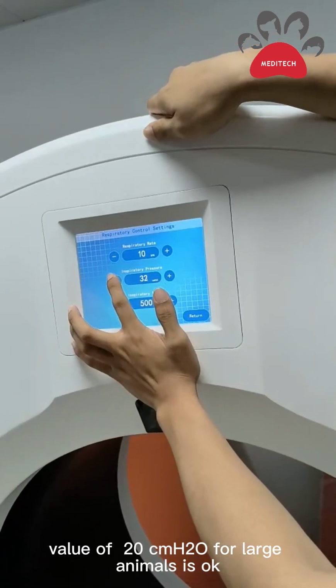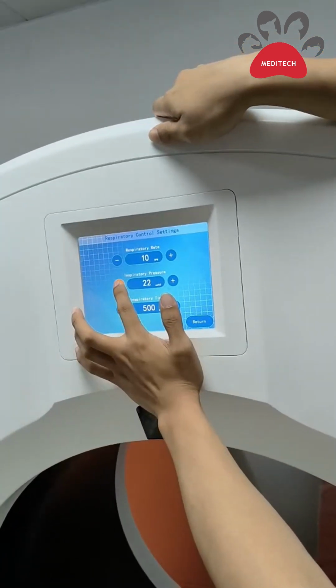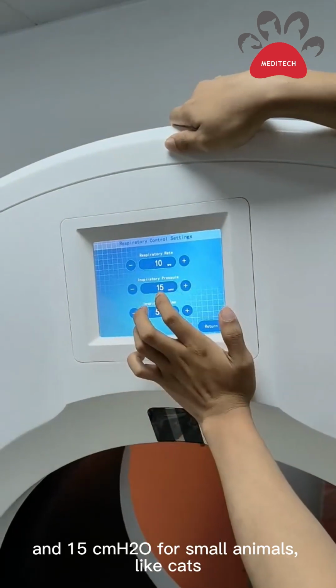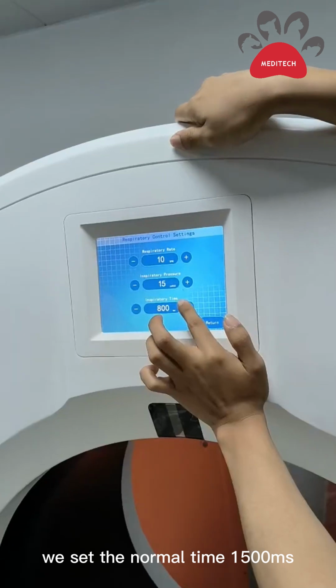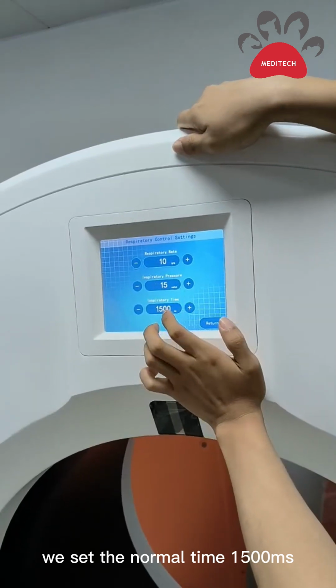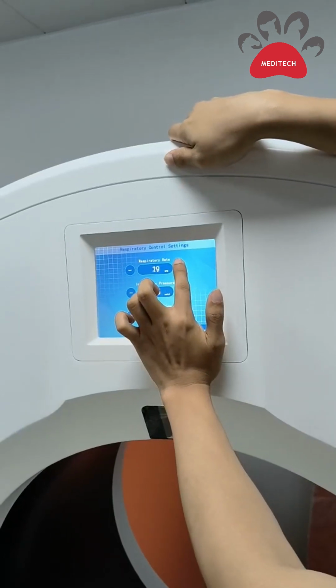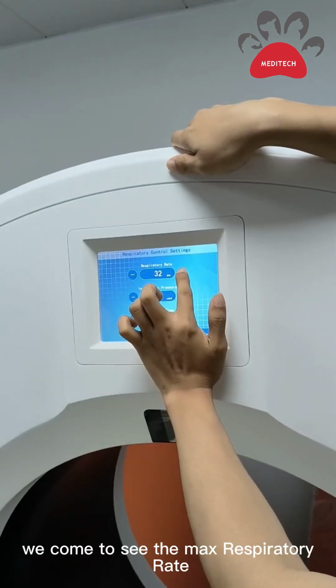A value of 20 for large animals is okay, and 15 for small animals, like cats. We set the normal value 1,500 milliseconds. Let's come to see the max value.